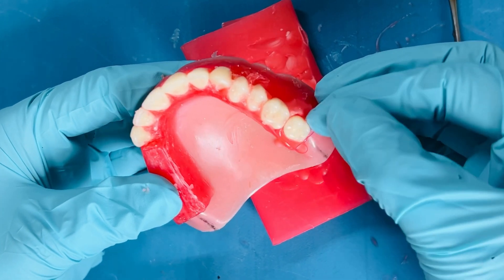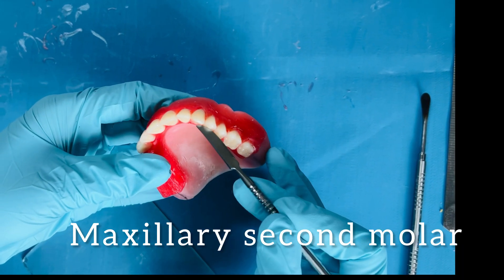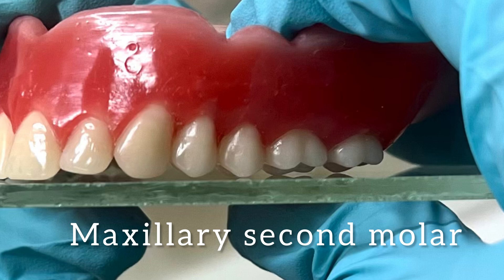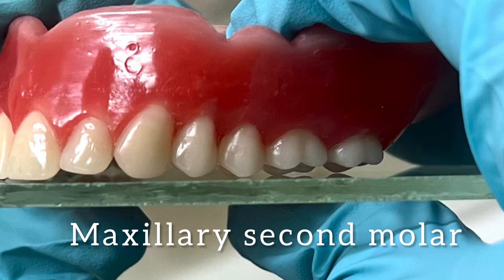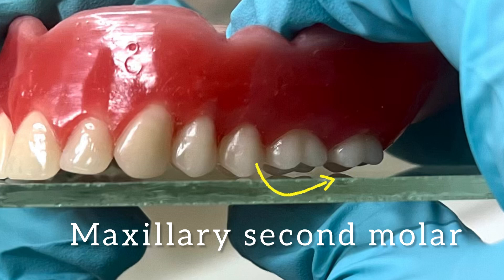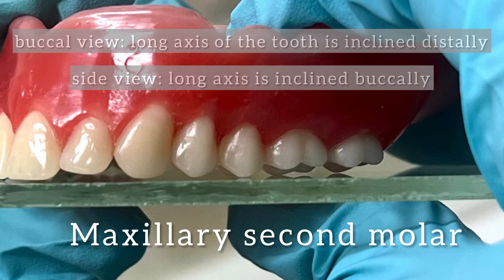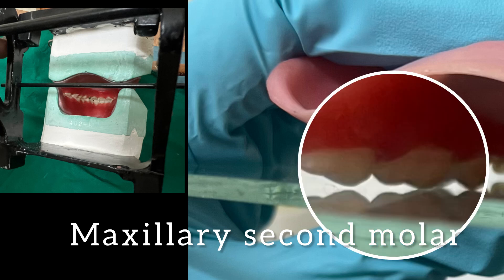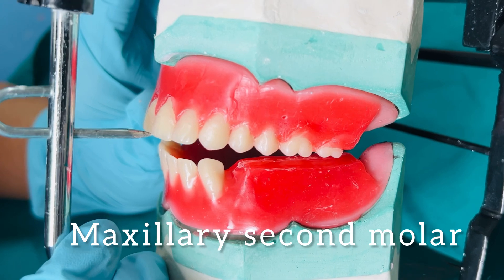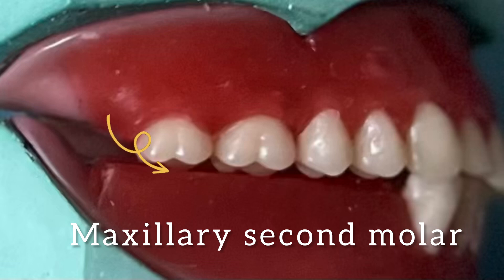The articulator is closed and make sure that the palatal cusp of the maxillary first molar approximates the reference line drawn on the lower occlusal rim. After sealing the wax around the first molar, we can proceed to the next tooth. The maxillary second molar is set in the same inclinations as that of the first molar. The difference lies in the glass plate relation. While checking glass plate relation, none of the cusps of the maxillary second molar touch the glass plate, but make sure that the mesopalatal cusp is closest to the glass plate.